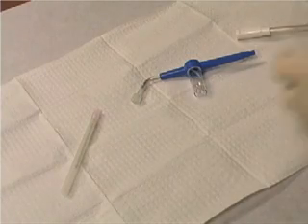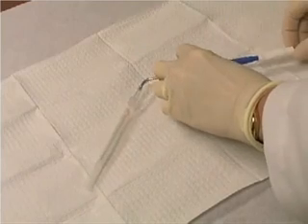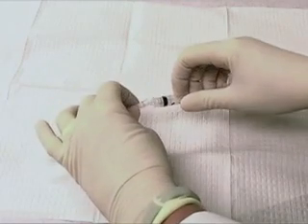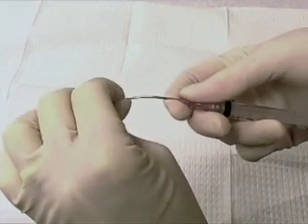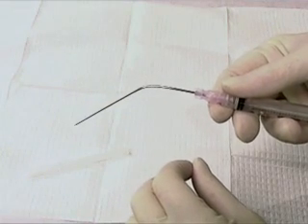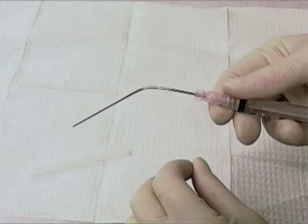Attach the needle to the tympanocentesis aspirator, then attach the aspirator to the suction device. If a tympanocentesis aspirator is not available, it is possible to use a 3-milliliter syringe connected to a 3-inch 18-gauge spinal tap needle that is bent at its midpoint to a 30-degree angle. Given the manipulation required to bend the needle and the relatively weaker suction achieved when using a syringe, this is not the preferred method.